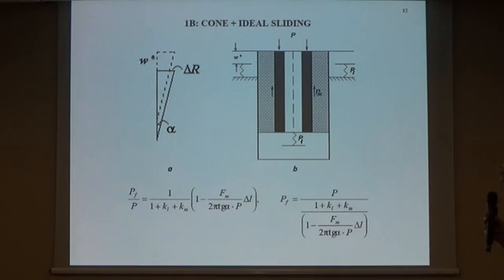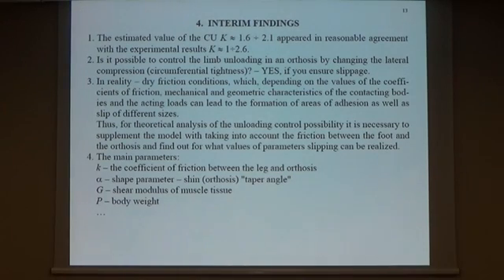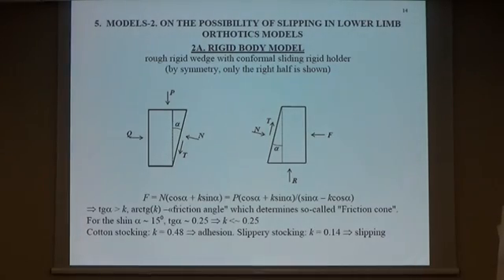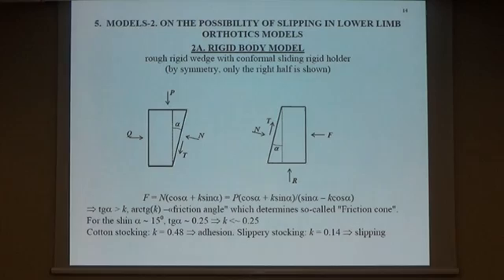That model didn't catch the dependence of unloading on tightness. So to take it into consideration, the model was revised. Some interim findings are listed here. The main point is that in reality there are dry friction conditions, and we might take it into consideration. So further, some models were proposed to take into consideration friction between the leg and the orthosis.